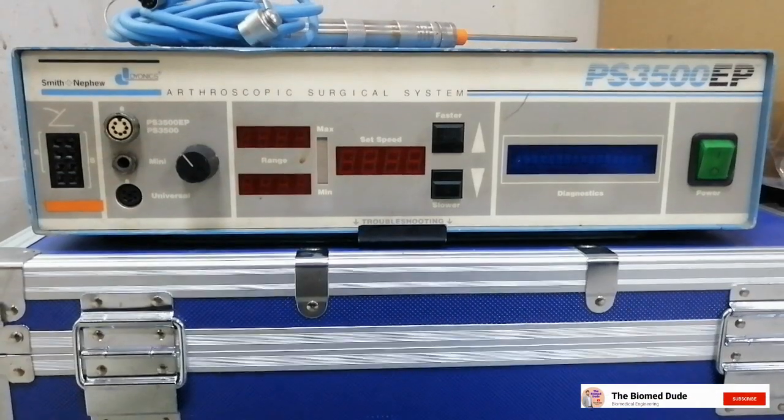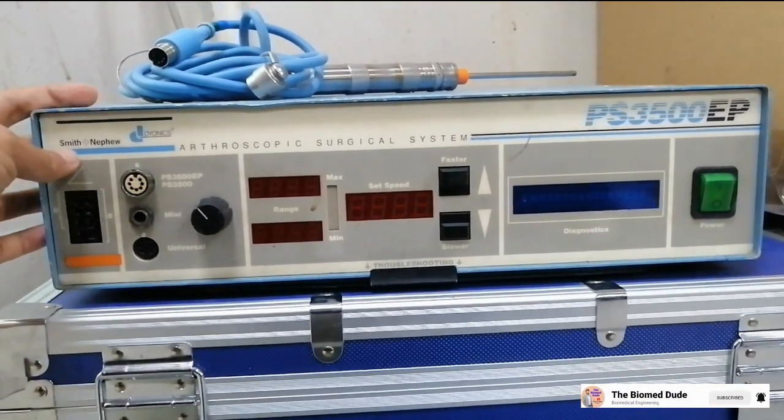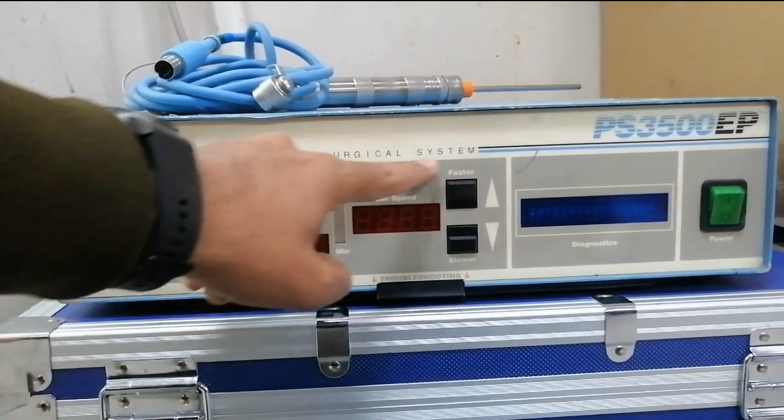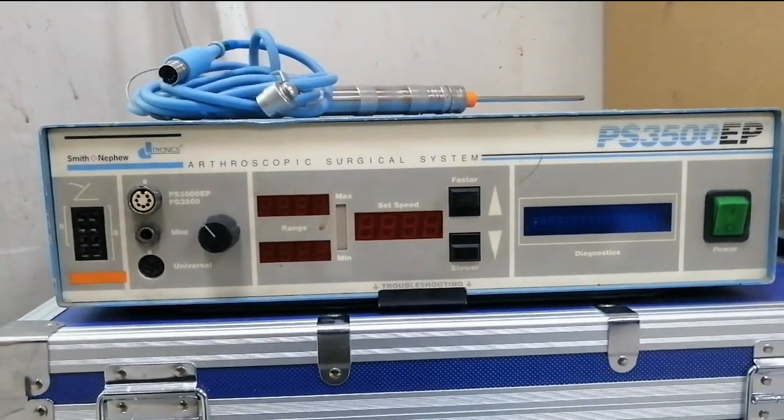Medical shaver systems allow physicians to perform more advanced surgical procedures. Here is the Smith & Nephew arthroscopy surgical system, model PS 3500 EP.